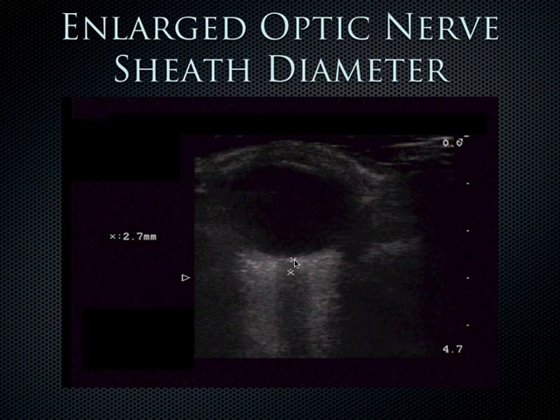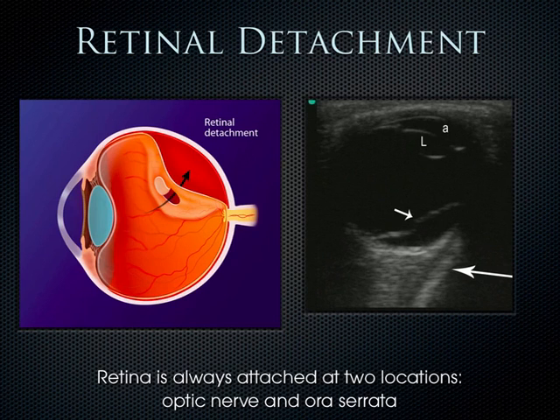You measure from the choroid, the back of the eye, 3 millimeters. You wait until that number reaches 3, and then you bring up another caliper, and at that level you measure the width of that sheath, that shadow that comes down. And when you have a retinal detachment, this can sometimes be difficult to diagnose under direct ophthalmoscopy, unless the patient has a really dilated eye and is really cooperative.